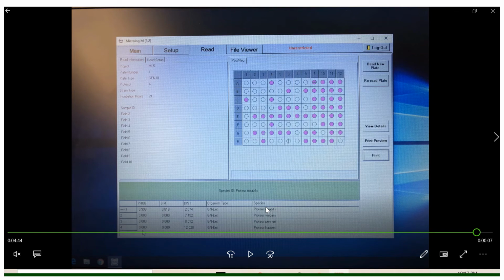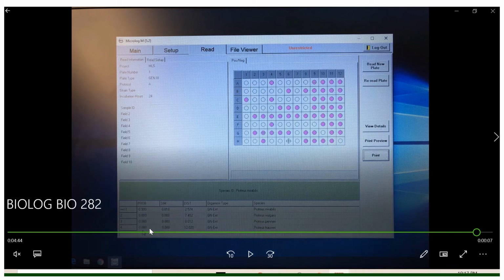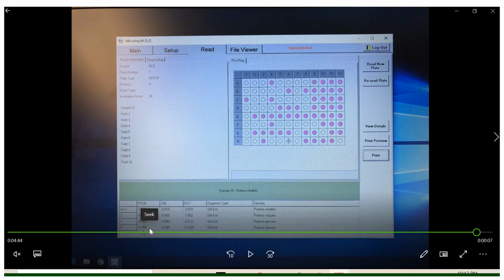Not all of you are going to have such accurate readings and have a 99% match, and you'll have to go through the other species listed and record the probability and refer to your other metabolic tests that you've conducted in class to determine your bacterial species.